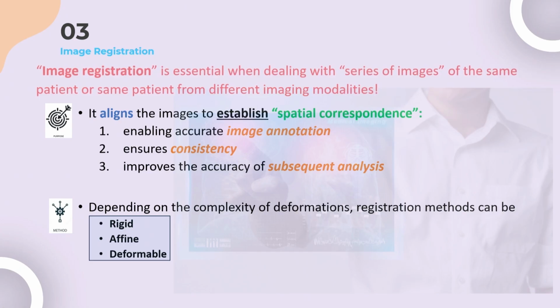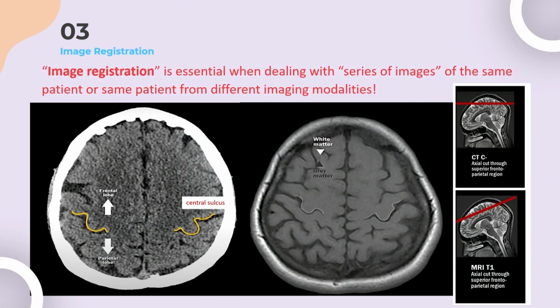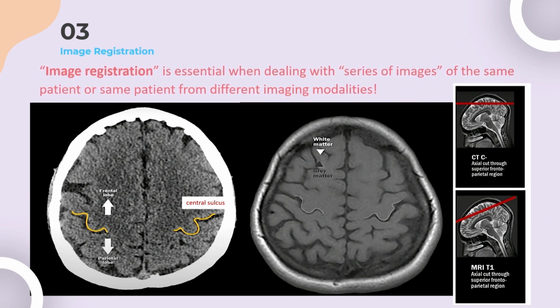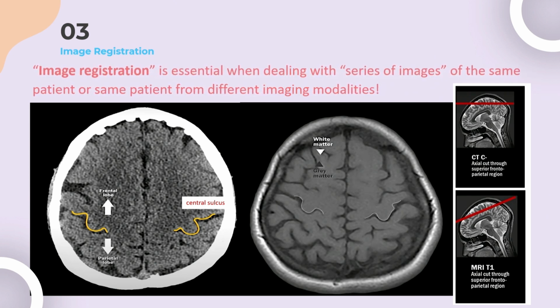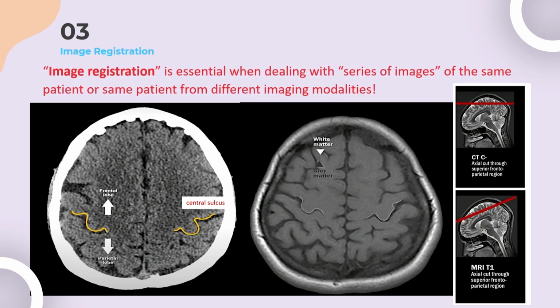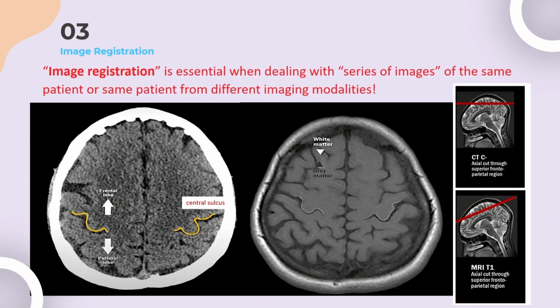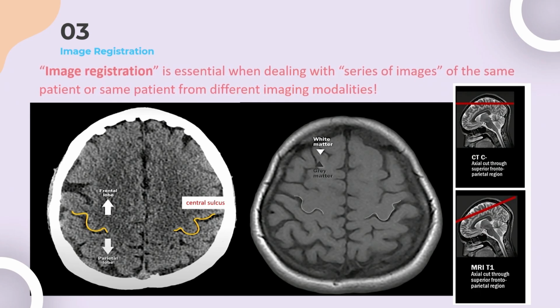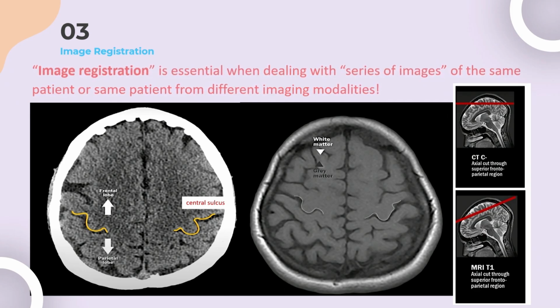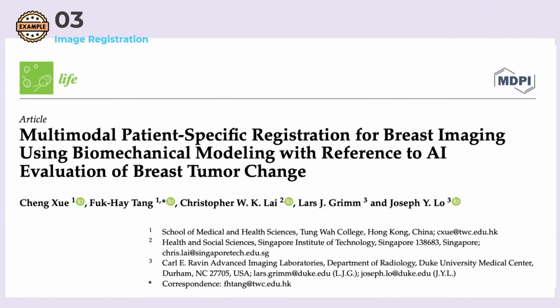And then image registration, I think, is a very difficult concept, because for different imaging modalities we collect the image with different postures. So between CT and MRI, our head will sometimes be chin down or chin up a bit. This is a variation between images collected from CT and MRI. So if you want to compare across a set of CT and MRI images, you may have to do something before you feed them into the AI models.